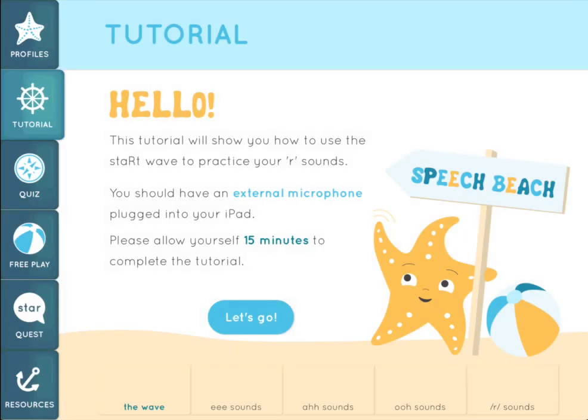This tutorial will show you how to use the START wave to practice R sounds. When you use the START app, you should have an external microphone plugged into your iPad. It's okay to use the inline microphone from a pair of earbuds.